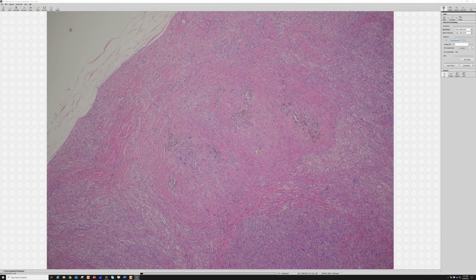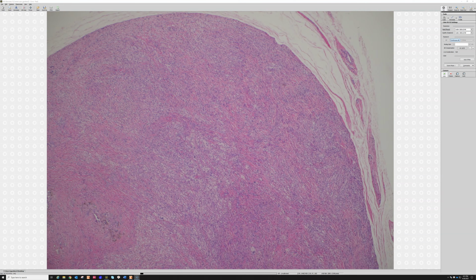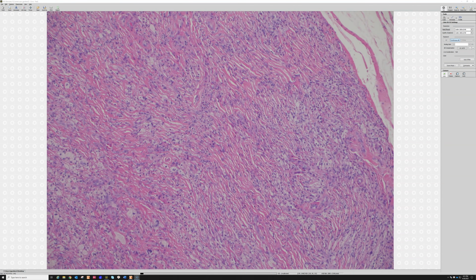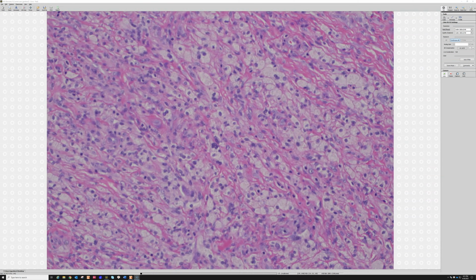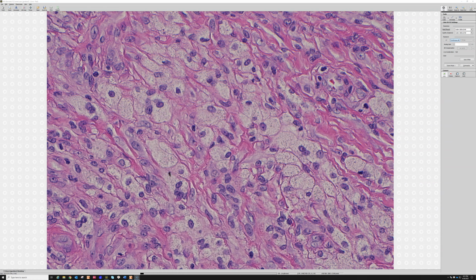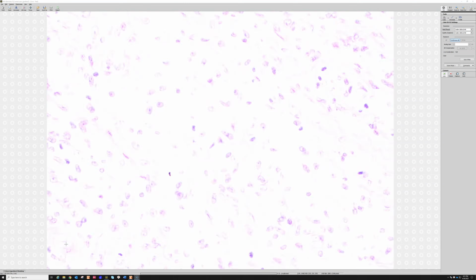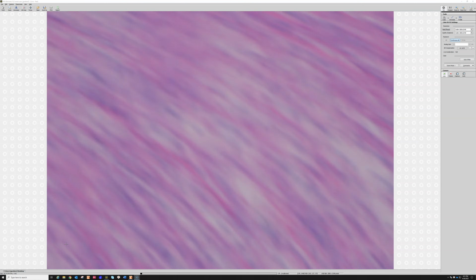And here we've got a tumor with a lot of different stuff going on. We've got a circumscribed nodule, very sharply circumscribed. We have areas with dense collagen with a cracking artifact in this case. We've got abundant foamy histiocytes or xanthoma cells, whichever name you like. And you can see they're foamy because they have little clear, that's a little hard to show on the scope here, but if you look, foamy cells actually have little tiny clear vacuoles in them.